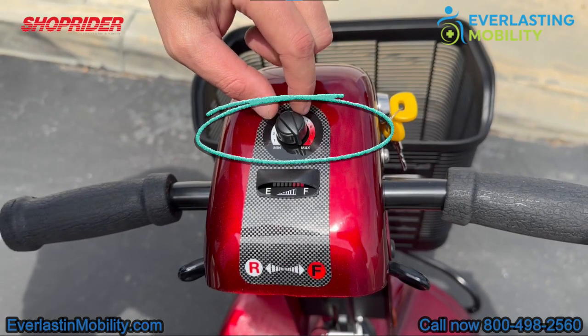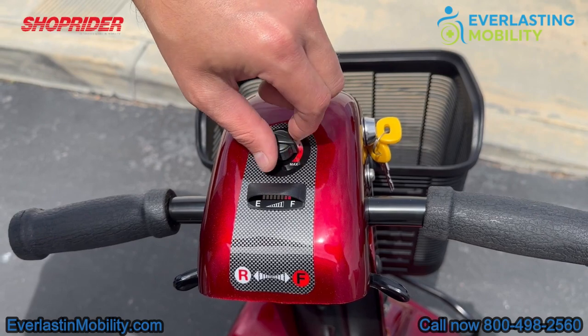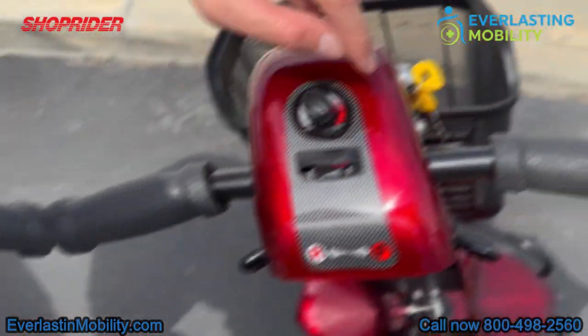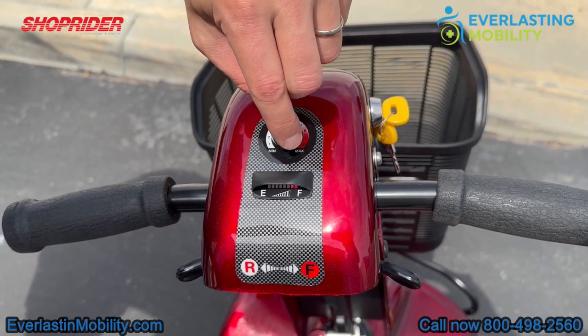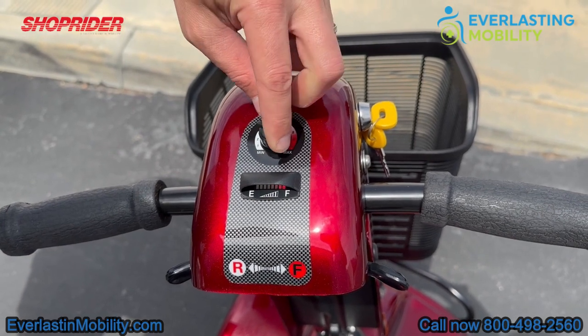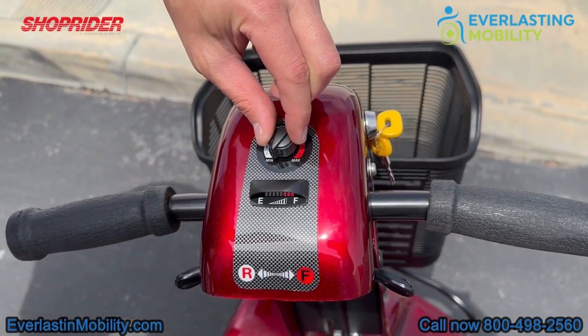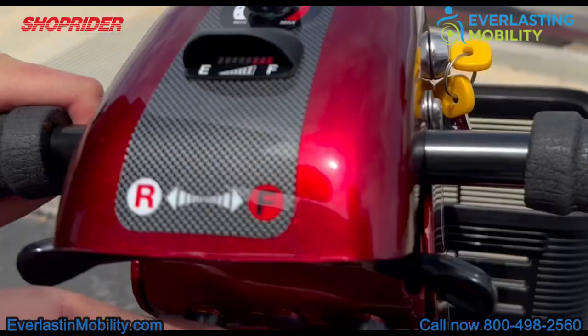Right above the battery gauge is the speed control dial. Turn it all the way to the right and the scooter has a top speed of five miles per hour at full acceleration. Turn it all the way to the left and the maximum speed decreases to about two and a half miles per hour — useful when riding around crowds or in a store. This is also an ambidextrous tiller, so you can accelerate forwards or backwards with just one hand.